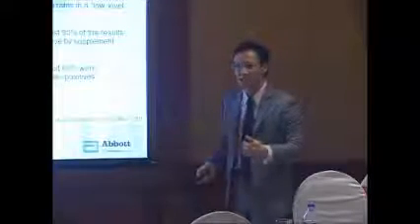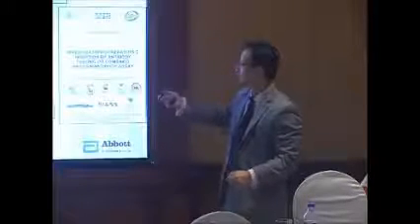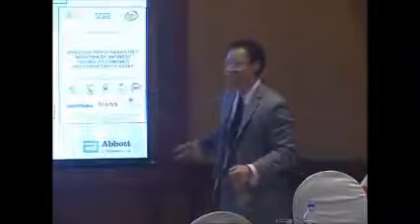False positive here. So an S/CO of 1 to 2.9, 95% of results are usually negative. Okay, this is on our assay. Now in England, they changed the guideline to incorporate our HCV antigen.